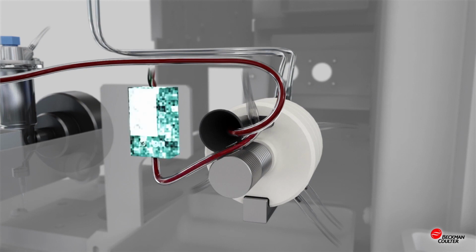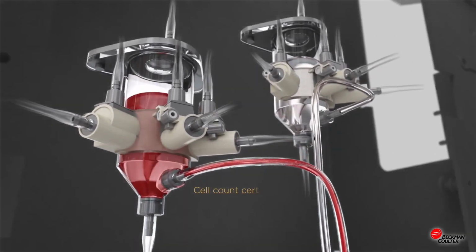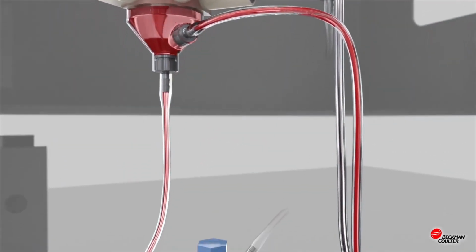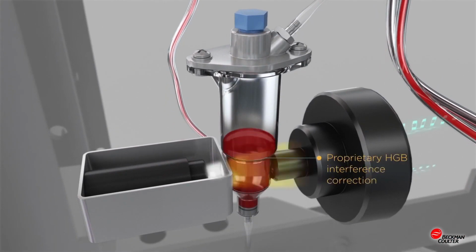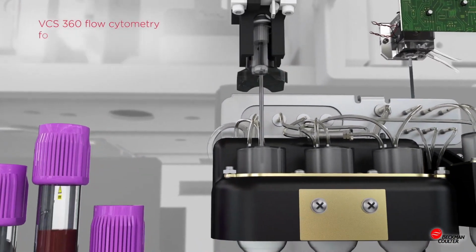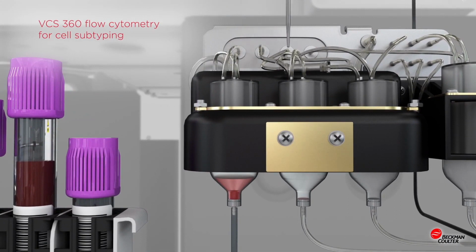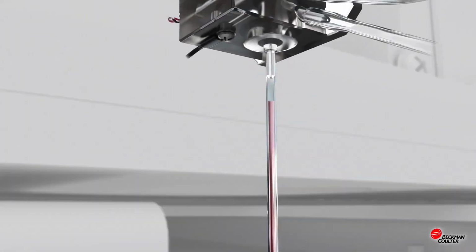Coulter's principle is applied through the use of two electrodes. One electrode, the internal electrode, is within the smaller container, and the other, the external electrode, is outside of the smaller container, but within the electrolyte sample solution. As the vacuum draws the sample cells through the orifice, the cell momentarily causes electrical resistance to the current as it passes through the orifice. This resistance is recorded, measured, amplified, and processed, which can then be interpreted by the computer into a histogram. The 3-part analyzer is able to differentiate between 3 types of WBCs: neutrophils, lymphocytes, and monocytes.